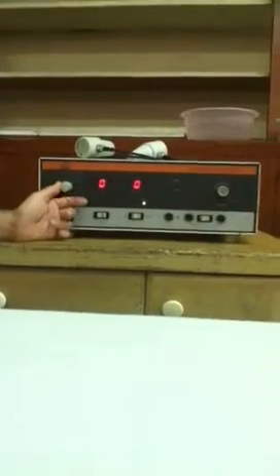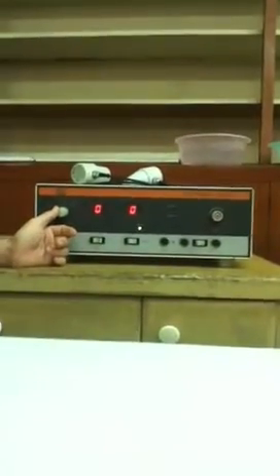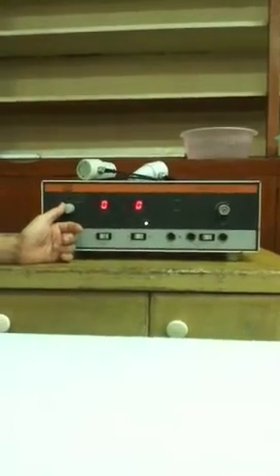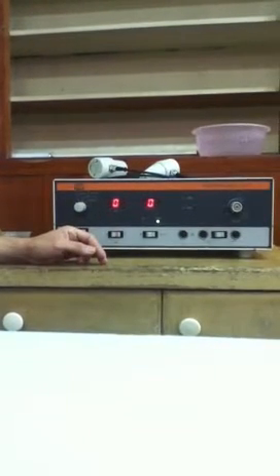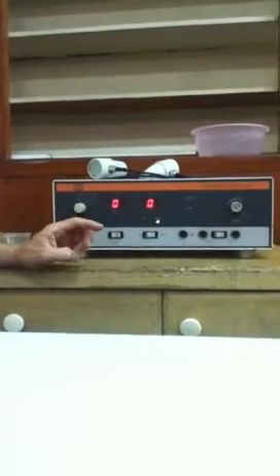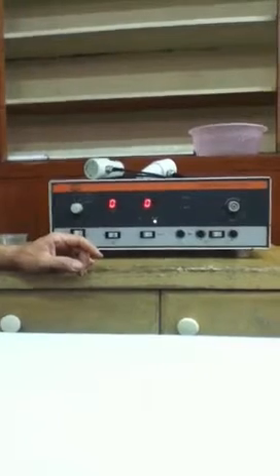The lesser values are the on phase, the larger values are the off phase. Facing it, on is on the left side and off on the right. The smaller value is usually the on, when it delivers ultrasonic energy.